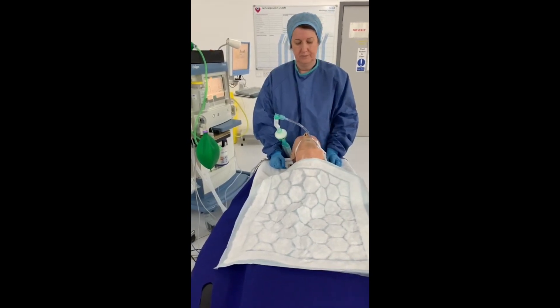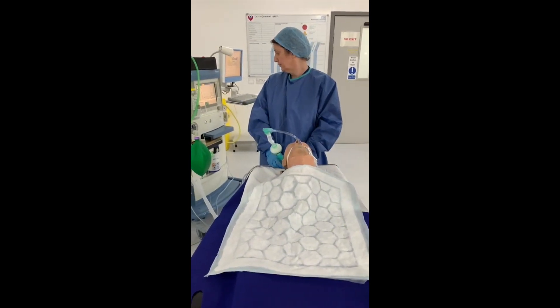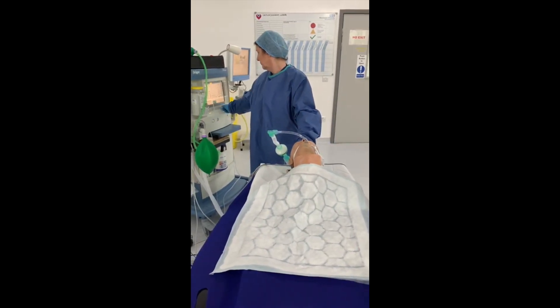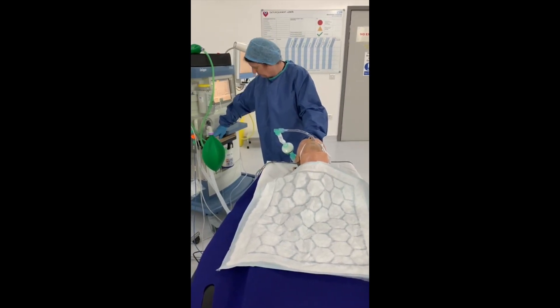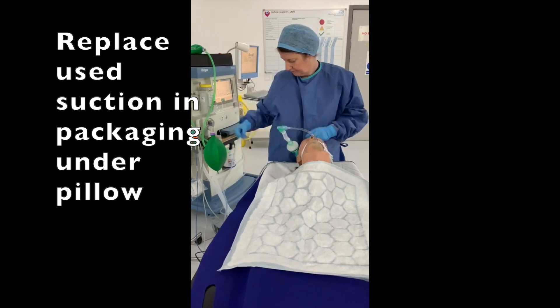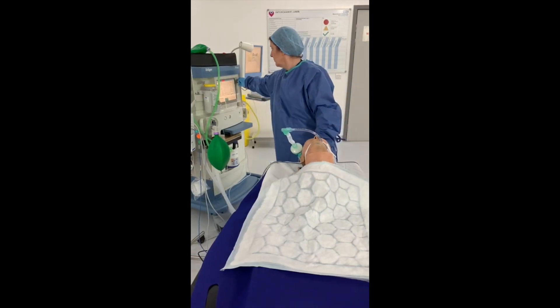It's the end of the procedure. We are going to maintain anesthesia, set the oxygen to 100%, and put the APL valve on five centimeters water. We're going to suction the patient, consider insertion of a bite guard, and coordinate the full team to transfer the patient to the patient's bed.